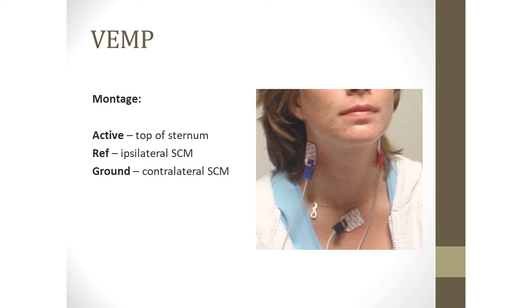You could divide this in thirds: lower third, middle third, upper third. Right in the middle of the upper third, right smack on that muscle as they turn their head and try to look at their shoulder. And the ground we were putting right here, I always complained about that. I didn't want to put it there on guys' hair and everything, and on women, I didn't want to go there with that.